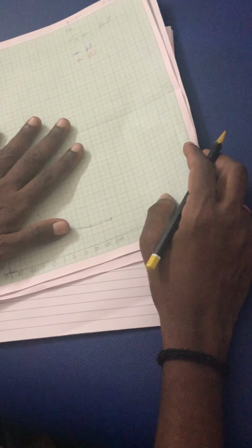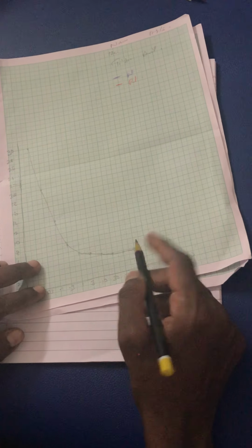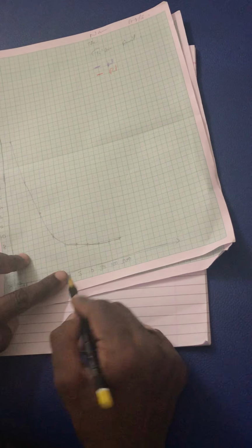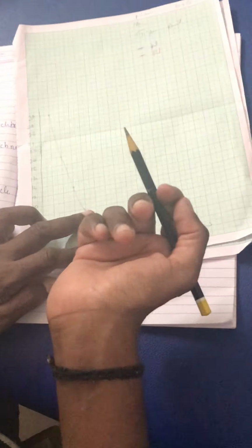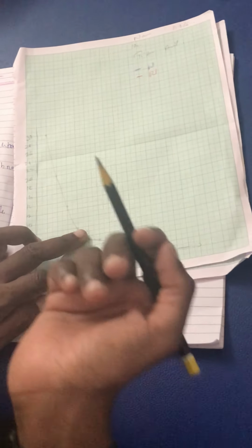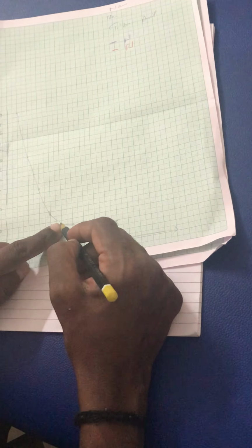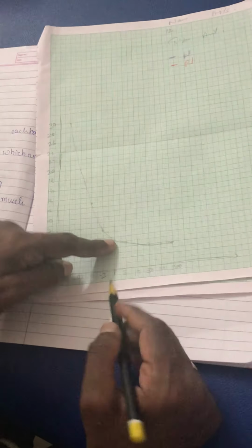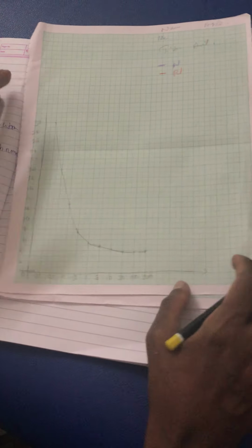Now I have plotted the graph. If you ask me to interpret it, this is a normal graph. Why? Because I started with a steady current and till 1 it was fairly steady. I use the word fairly steady, and in the next lecture I will explain why I call this fairly steady, not completely exactly steady. And then from there onwards you can see on the left-hand part of the graph it is steeply rising. So this is an innervated curve.